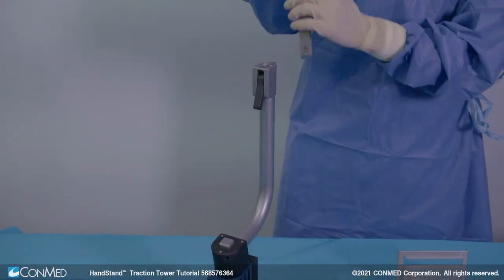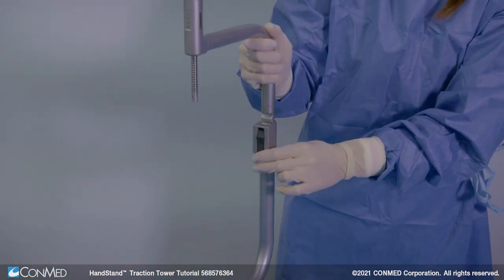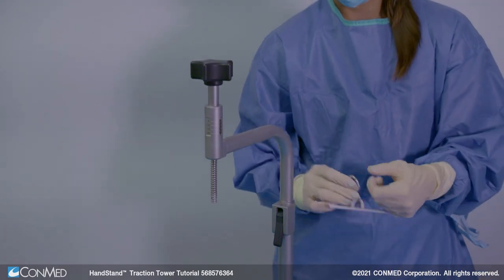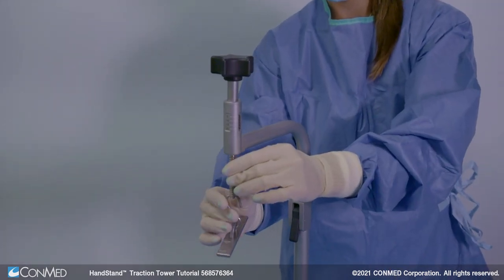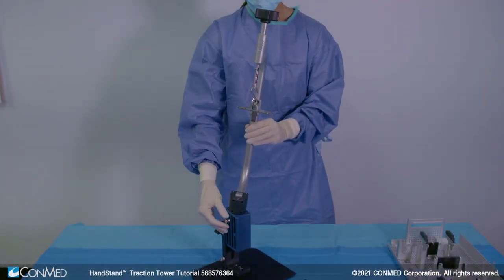Then, depress the black lever on the lower arm and insert the upper arm. The height of the upper arm can be adjusted depending on patient arm length. Hook the scale rack onto the threaded rod in the upper arm. The tower is now assembled and ready for patient positioning.